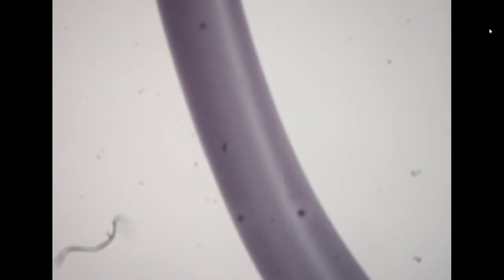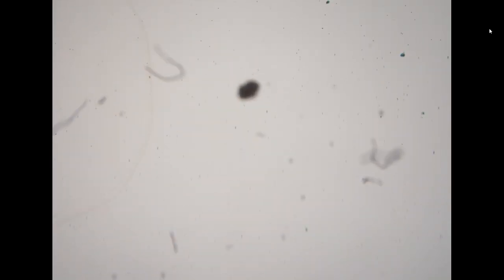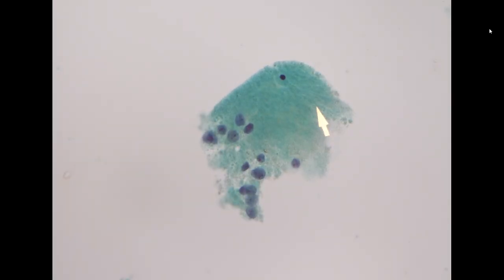So the next specimen is from parotid gland aspiration. The patient is a 64-year-old male with a past history of smoking for 30 years. Before we see the slide, we were already thinking, okay, this could be a Warthin tumor, right? The liquid-based cytology is very paucicellular. Basically, there's very scant cellular component here, and we only see some granular material and some unknown cells over here, and that's it.